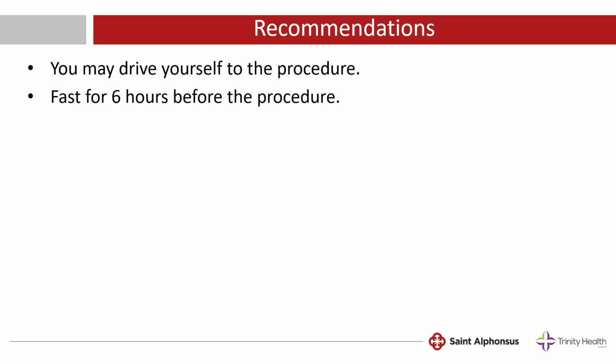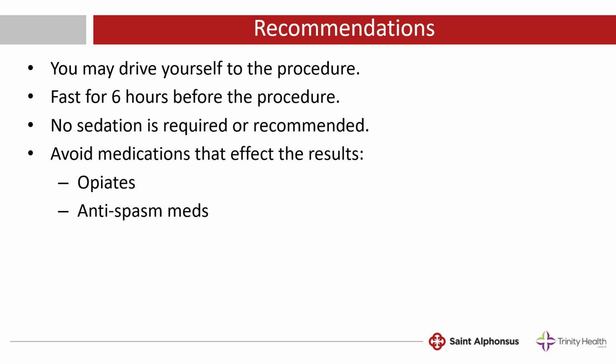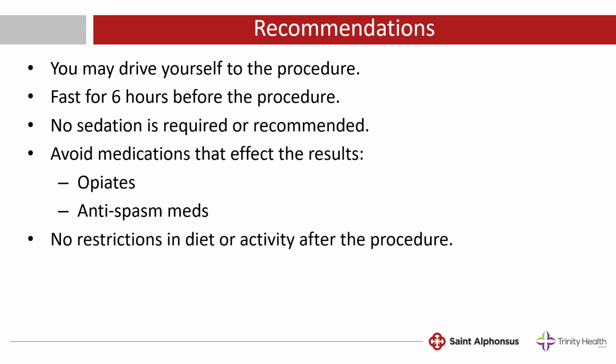We recommend you fast for 6 hours before the procedure, so if your procedure is early in the morning, please don't eat or drink anything after midnight. No sedation is required or recommended for this procedure because it can interfere with the results. We do recommend avoiding medications that can affect the results like opiates or narcotic medications for pain and antispasm medications. After the procedure, there are no restrictions in diet or activity.